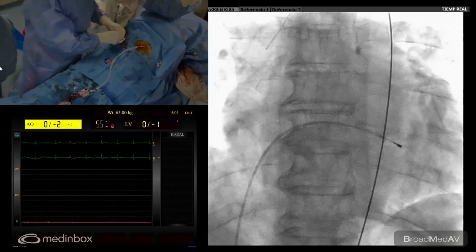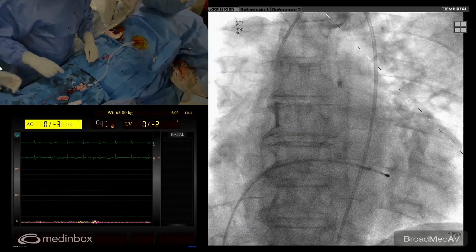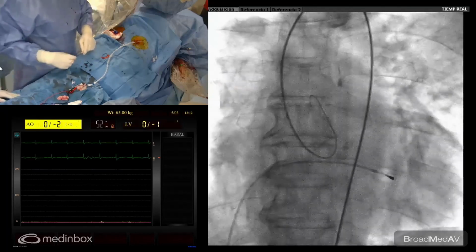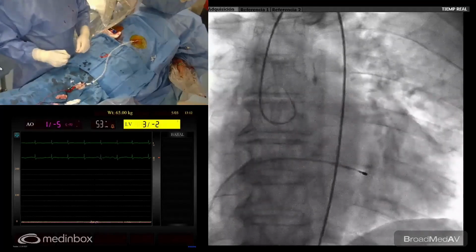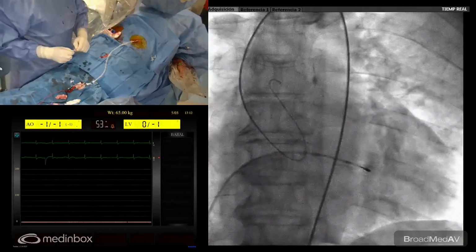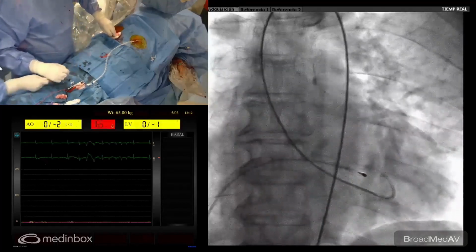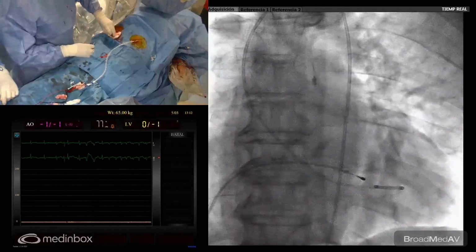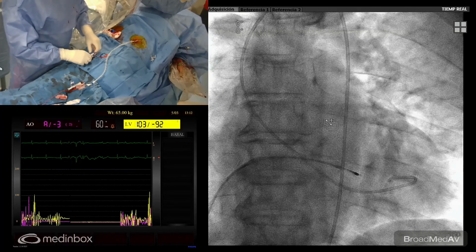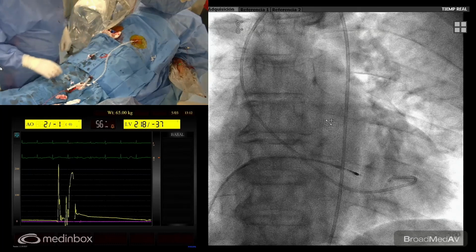Okay, now we are going to cross the valve, and then we are going to put this 6 French guiding catheter. Separate it, Juan. We are trying to go in, no, here. Okay. In our way, we need it sometimes. Most of the cases are easy. And another, like last week, we had to change for the Amplatz catheter and so on. Not yet. We are going to put the coronary catheter.